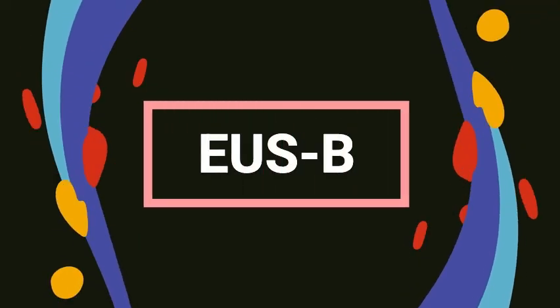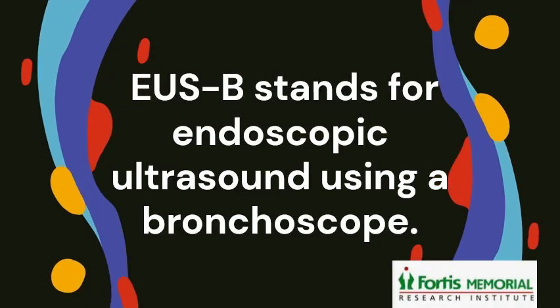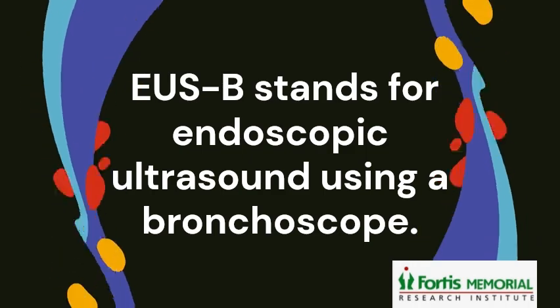EUS-B. EUS-B stands for endoscopic ultrasound using a bronchoscope.